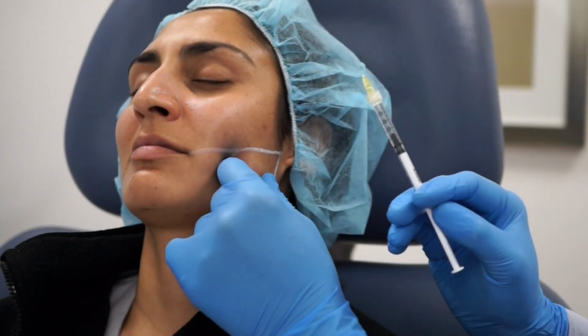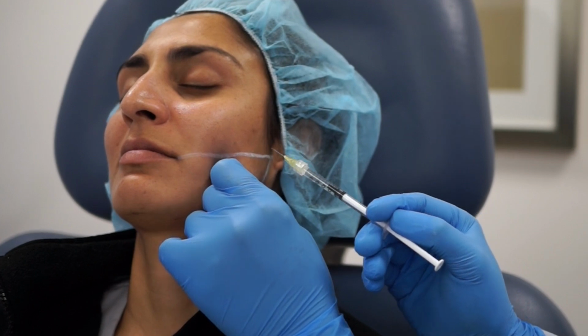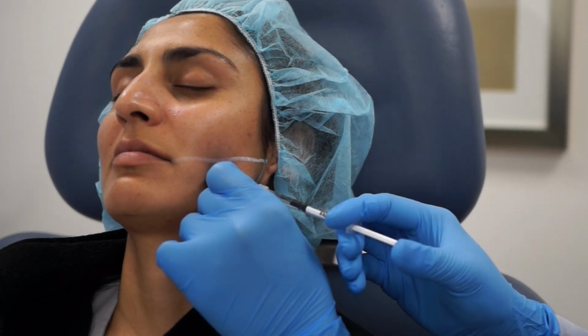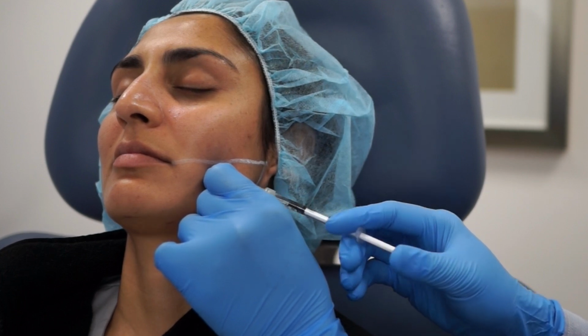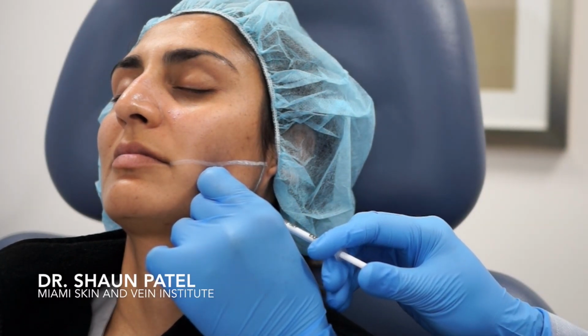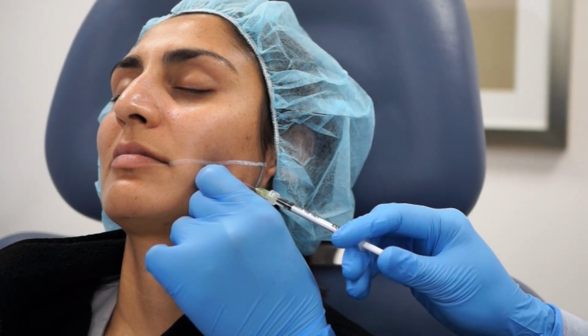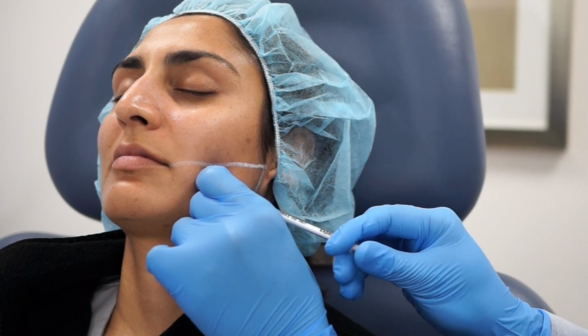Alright, so bite down for me. Feel that, and then I'm just going to usually do about 4 injections here. Alright, bite down and relax. Okay, this is the first injection, and we do 20 units on each side, and I usually do a couple of mixed injections here. Almost done. And that's it. That is a Botox injection for Masseter Hypertrophy.